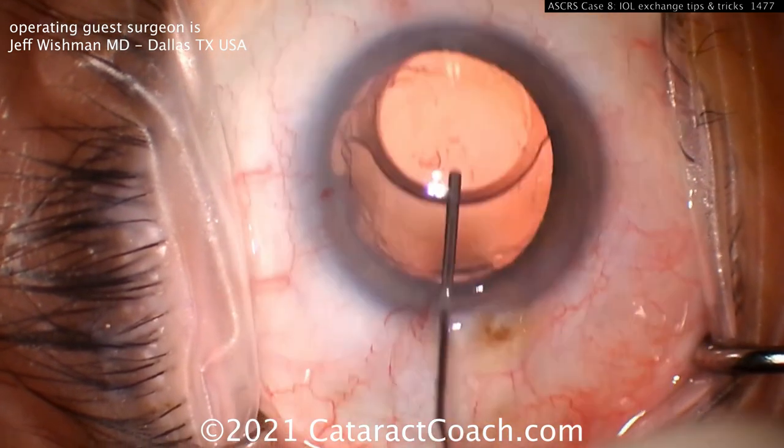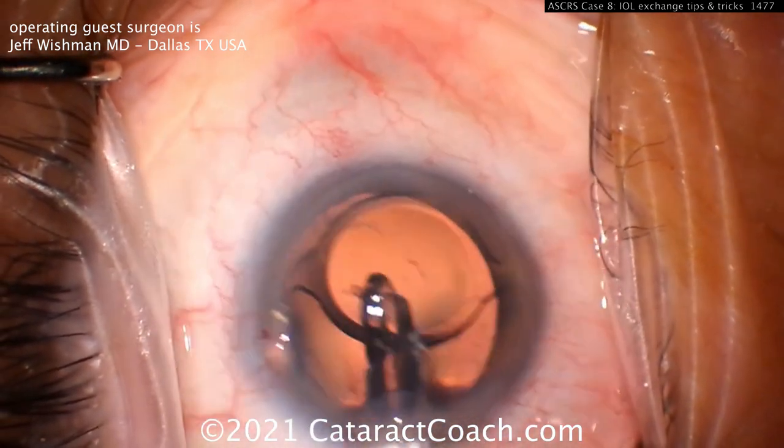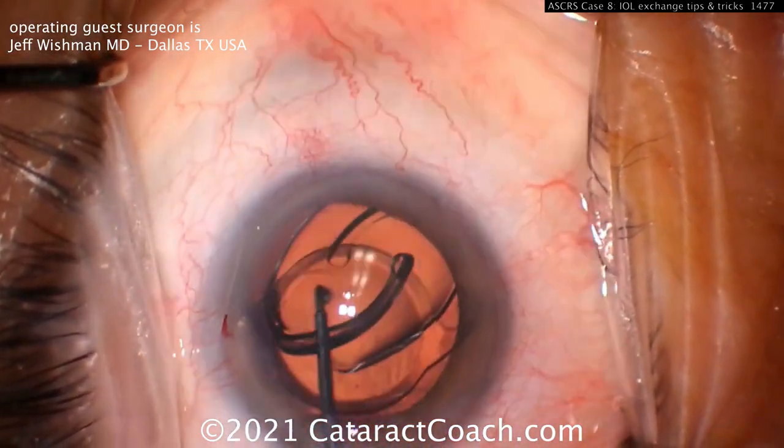Here's another method from Jeff Whitman — you can cut the lens if you'd like. The old lens comes up and is now in the anterior chamber. The new lens goes into the capsular bag so it will protect the posterior capsule, which is very important especially when placing a sharp instrument like micro scissors inside the eye.